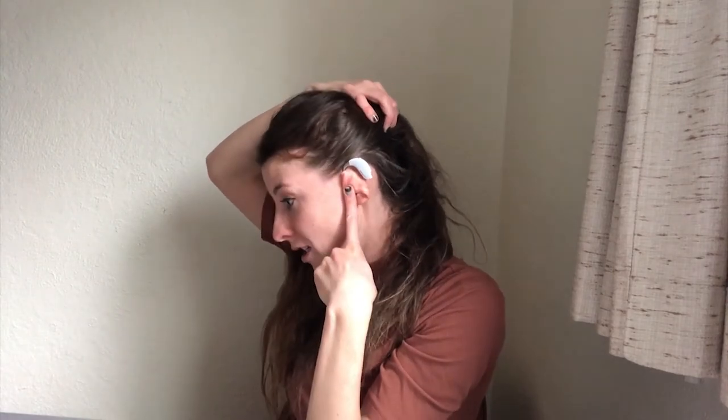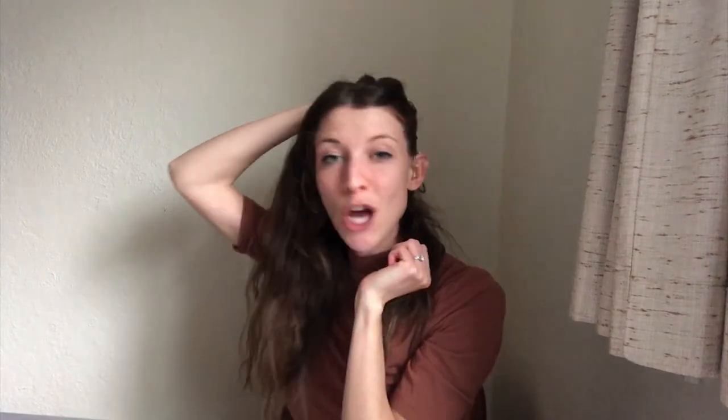I wear white ReSound Enzo 3D hearing aids and I have gold molds. I love them so much.